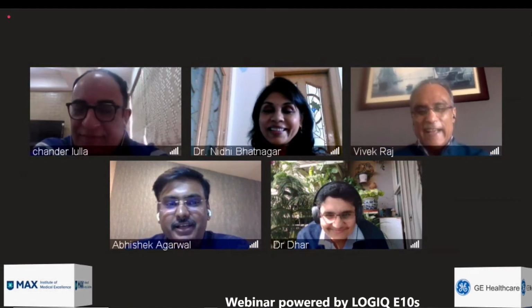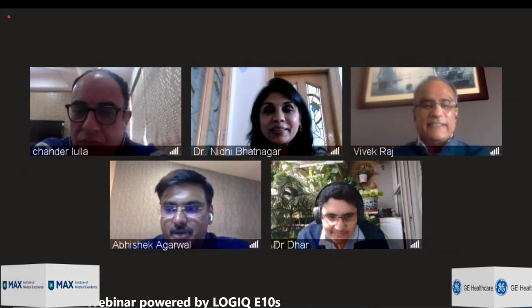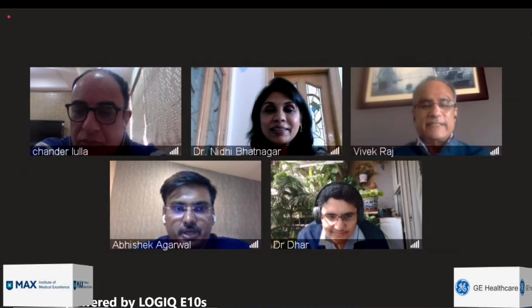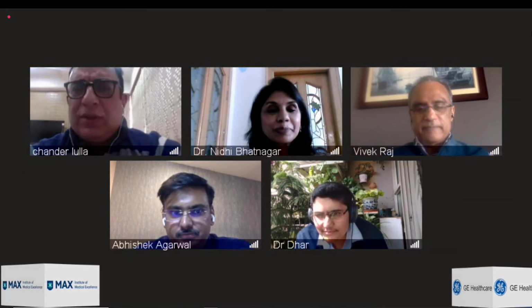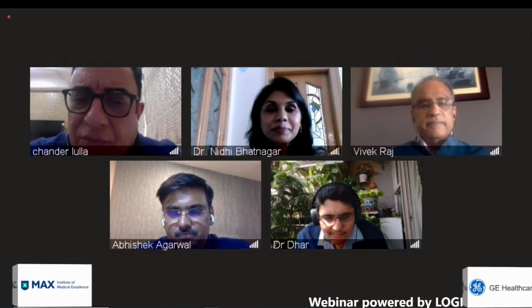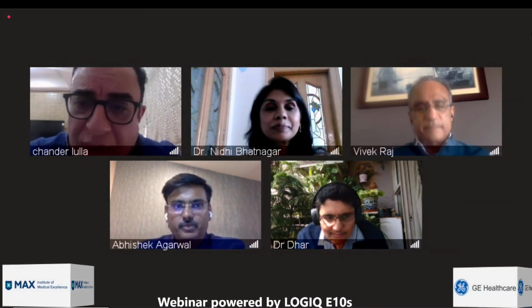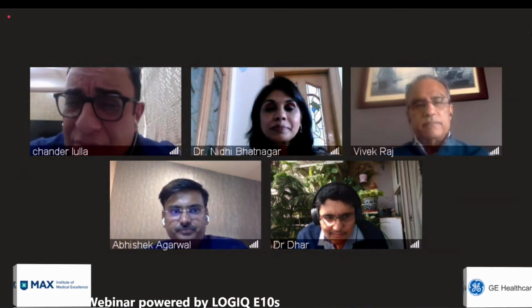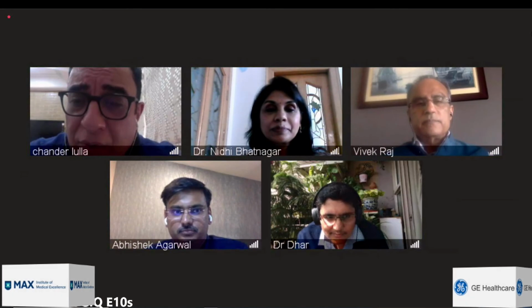Dr. Lulla, in real world conditions, how often do you have to send a patient back because you are not able to get proper values? Less than 1%. I've never really had no values coming up, because the quality control methods allow you to select your areas very well. But if a patient is extremely morbidly obese, I do have a problem sometimes.